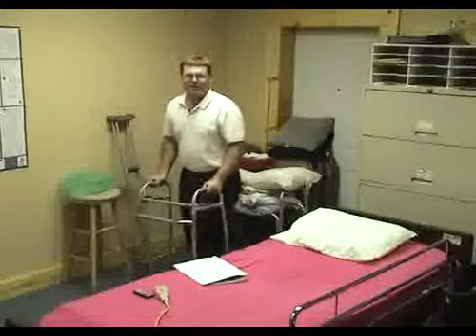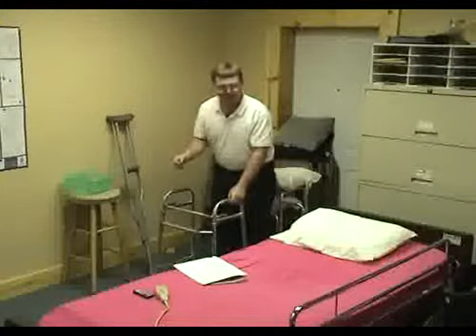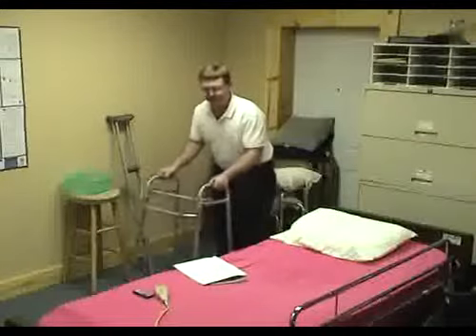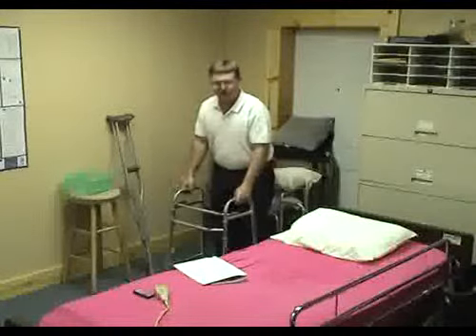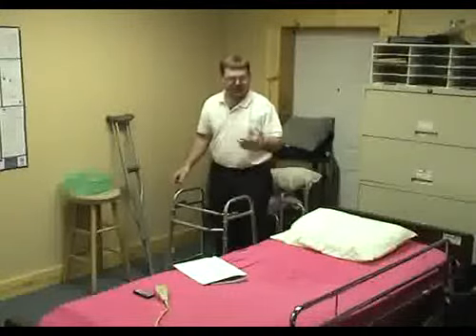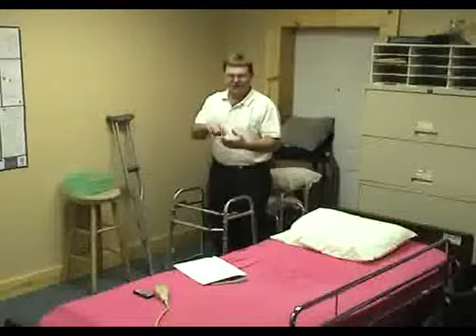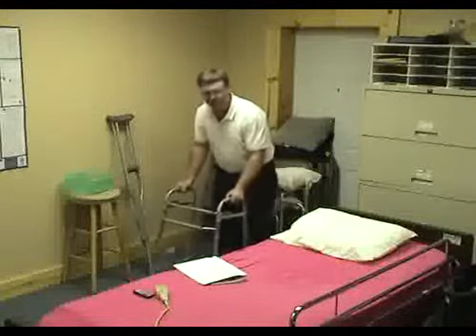If a patient doesn't have the strength or the grip in the hands to lift the walker to move it forward, they have a walker that has wheels on the front and on the back. The best thing to do, they have pads, but you take a tennis ball, cut it in a cross shape, and put it up underneath there. You'll be surprised how it eliminates the friction.